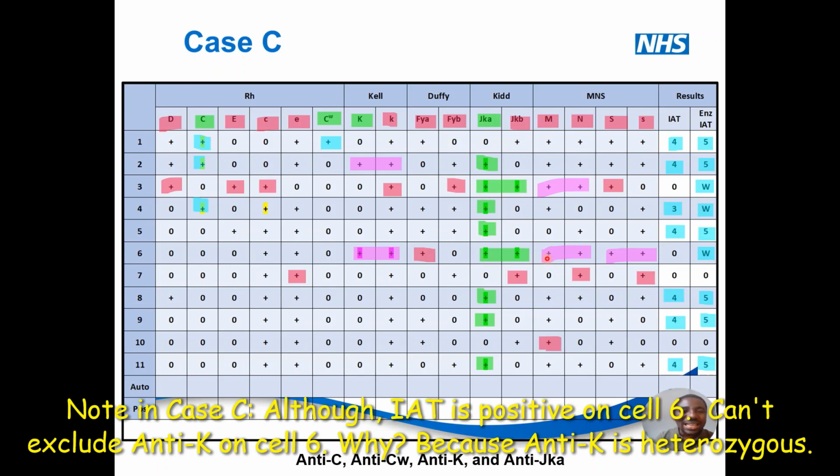So now, if you look at that, you will see that we cannot exclude big C. Why? Because anywhere that it is positive in big C, it is positive here, okay? And even in the enzyme. And with this antibody, you can see there are more reactions here. There's also more reaction here. So it seems like what is here is not an antibody that is destroyed by enzyme. That's the point. That's why I tried to put this. Unlike what I've been giving you previously, there are 2 antibodies here, and both of them are not destroyed by enzyme. That's what I've put here.